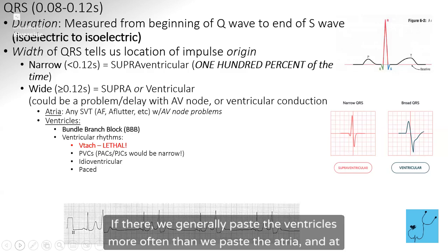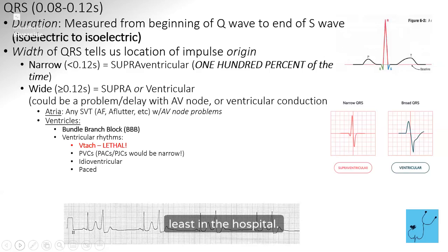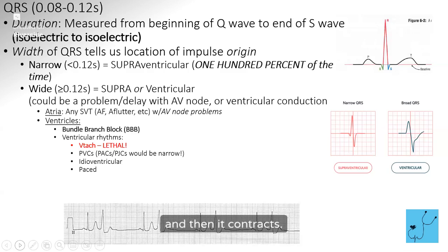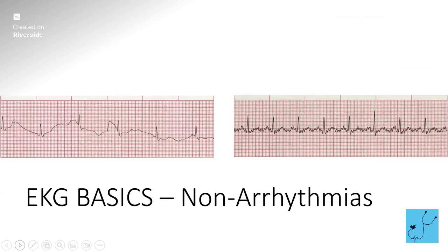We generally pace the ventricles more often than we pace the atria, at least in the hospital. And we'll see the pacer spike and then the wide QRS because we're pacing the ventricle, and then it contracts, so it's a wider QRS.